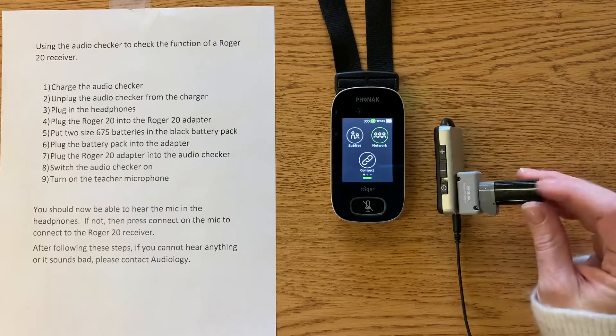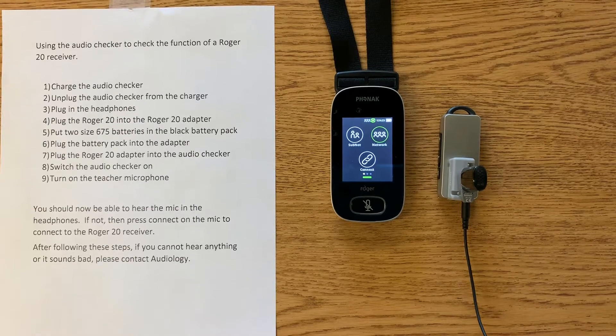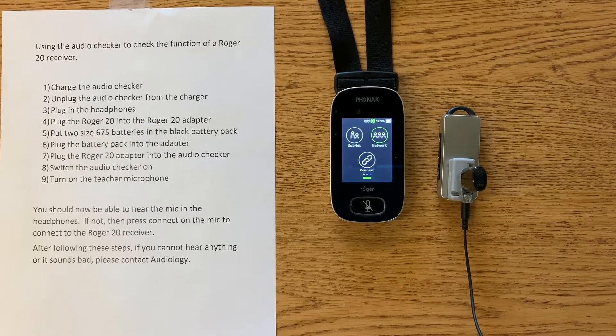If you're not sure if the batteries are good in the battery pack, you can use a battery tester or you can just replace them with new ones. If you're still having trouble and you're not getting a good signal to that Roger 20, please contact Audiology.